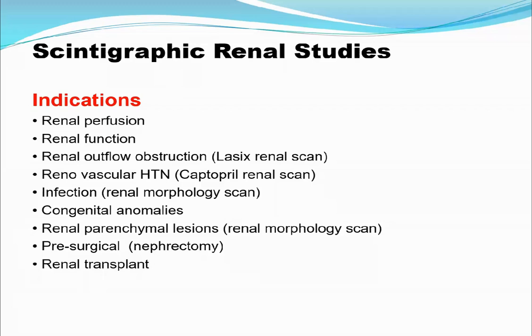detection of renal parenchymal lesions by renal morphology scan, and take a decision to nephrectomize or remain any kidney pre-surgical. Lastly, follow-up of renal transplant and diagnosis of all parenchymal medical complications and surgical complications.